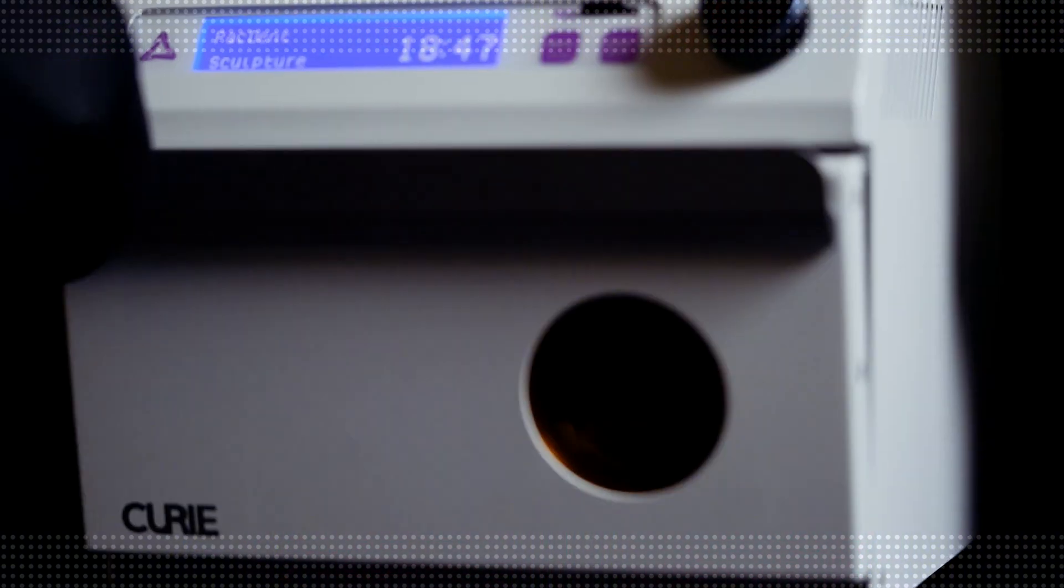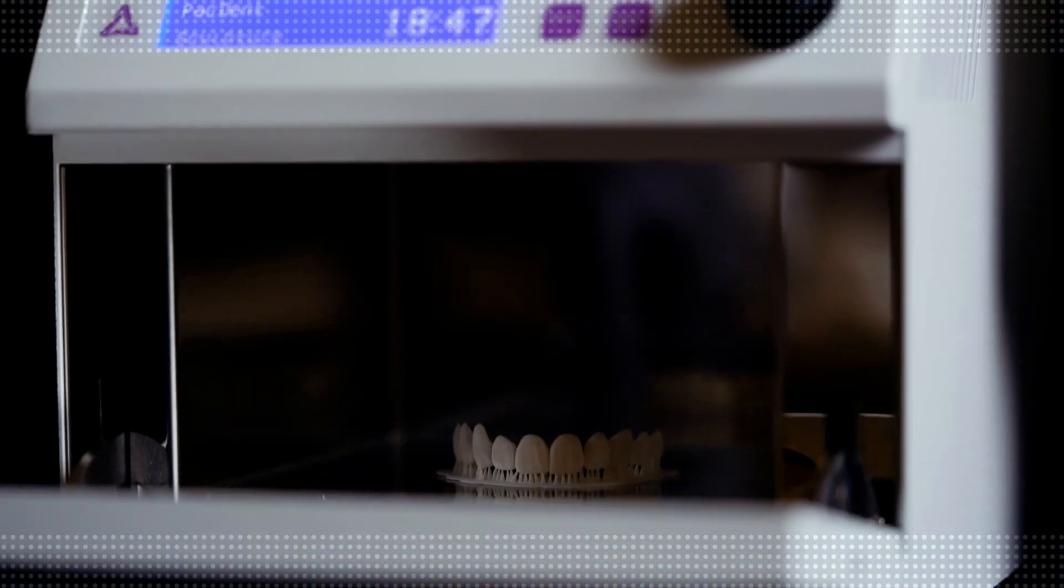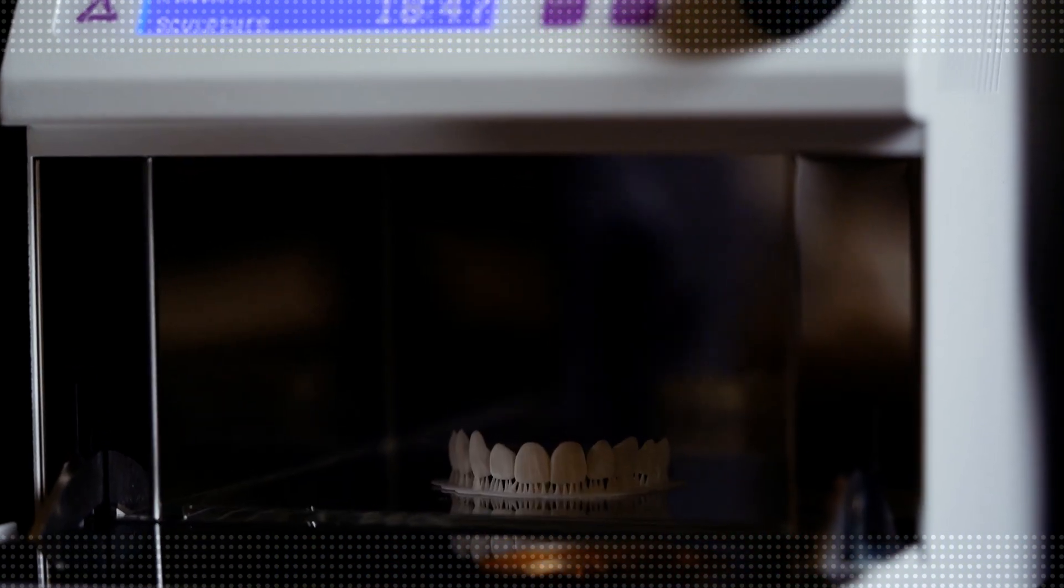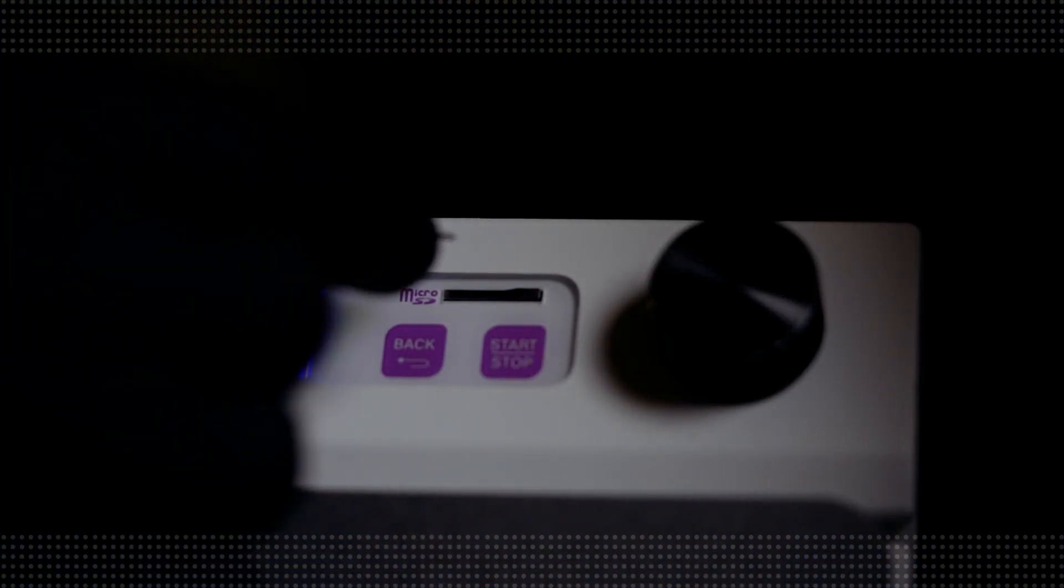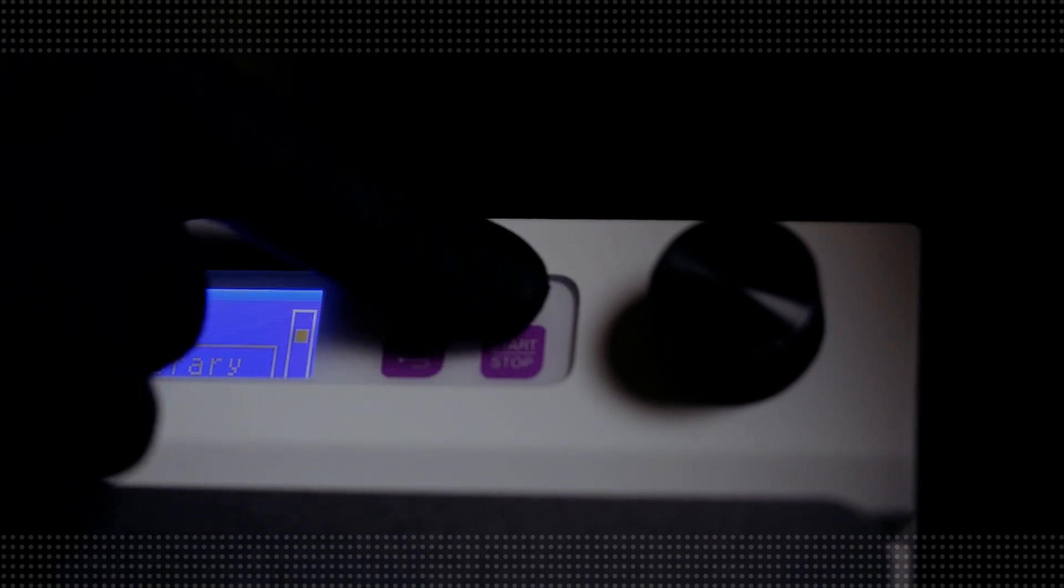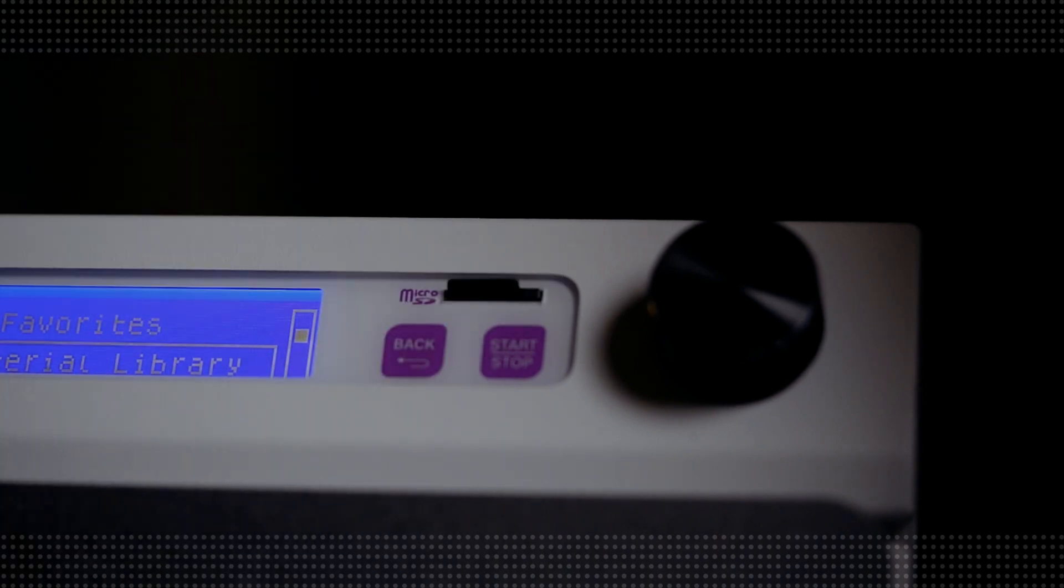The Curie, 70 watts of power, distributed over 31 LED bulbs, generating three different wavelengths of light: 365, 385, and 405. This ensures a very deep cure. What we really love, though, is the ability to instantly upgrade all the resin cure profiles simply by inserting a micro SD card.